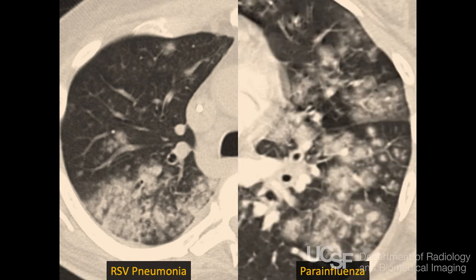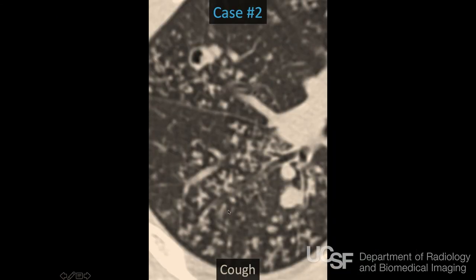Here's another case. This is another virus — parainfluenza in this case. I don't know the difference between the viruses that cause this, but you can see similar findings. You see larger areas of consolidation, but when you look at areas that are less affected, we see these little centrilobular nodules sparing the pleural surface. This is one of the most common things we encounter — small airways disease from an infectious bronchiolitis.